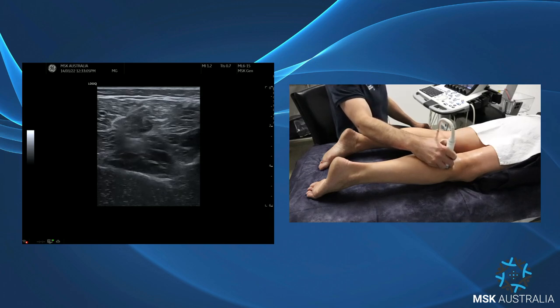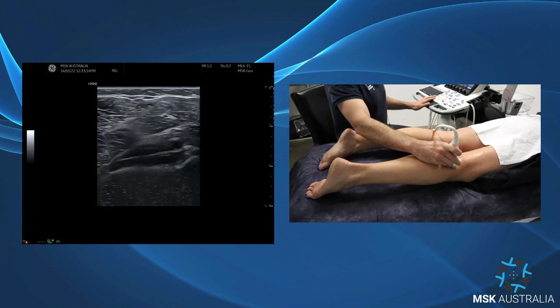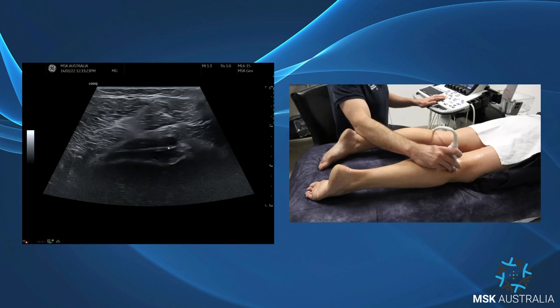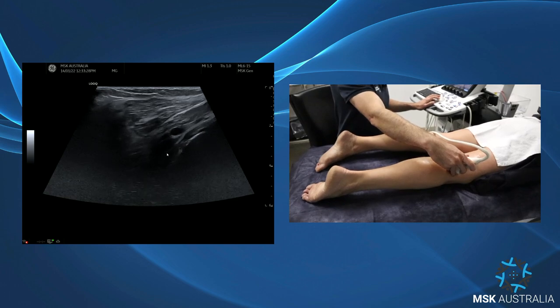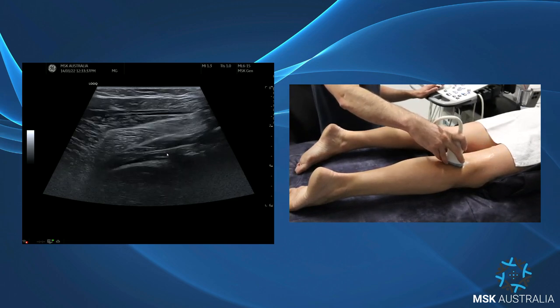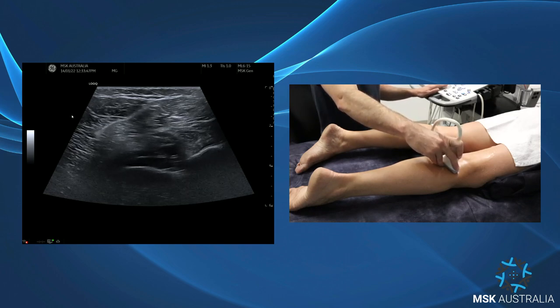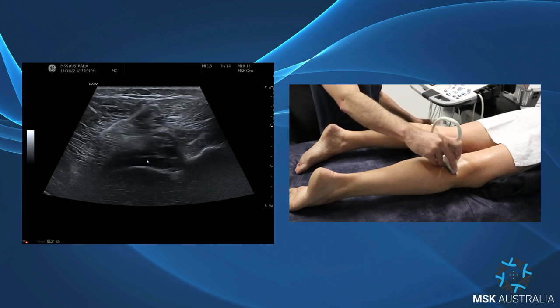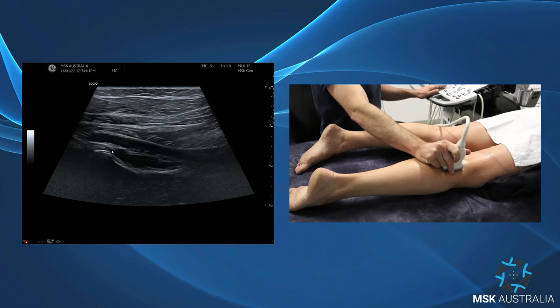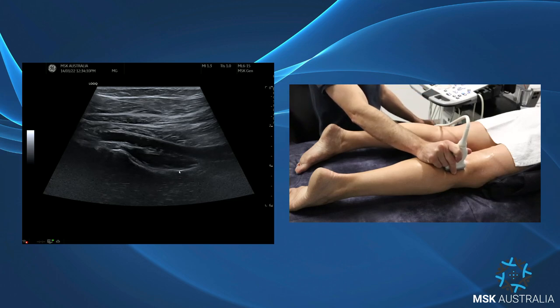If we're thinking about Botox injection — particularly if we haven't seen an abnormal muscle variant — it will be about injecting the popliteus muscle. Here's the artery; popliteus runs obliquely with its origin in the popliteal fossa under the lateral collateral ligament, then comes across in an oblique orientation under the artery. To inject, we come from the medial side away from the nerves and inject under there with Botox. My landmark for popliteus is to go in long axis on the back of the tibia — knee joint, come down inferiorly, popliteus is there with the artery generally over the top. That's one of the variations we look for when assessing for popliteal artery entrapment.